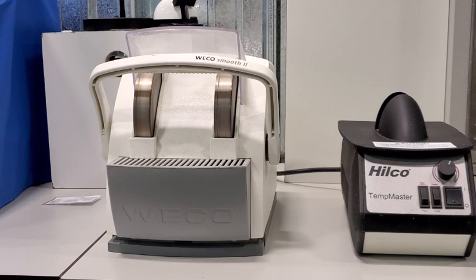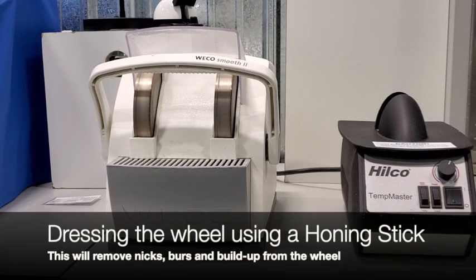The next piece of maintenance that we're going to talk about is as needed. Obviously we've already talked about the sponge, so sooner or later we will have to replace it. If your sponge goes bad, you're simply going to pull that sponge out and insert a new one, depending on what unit you're using. And then the main one that I can show you today is dressing your wheel.